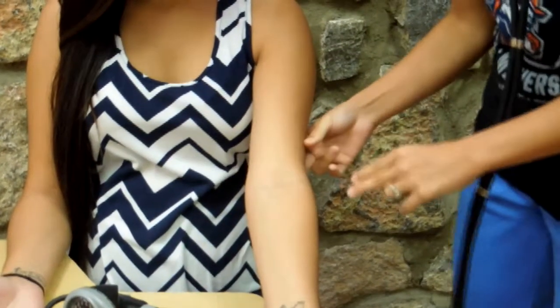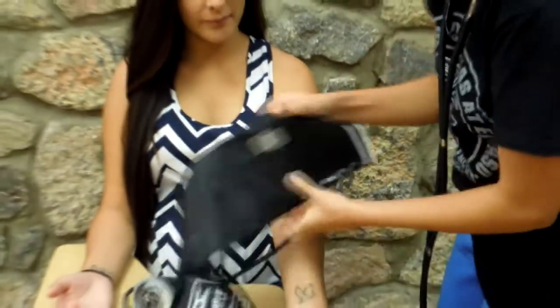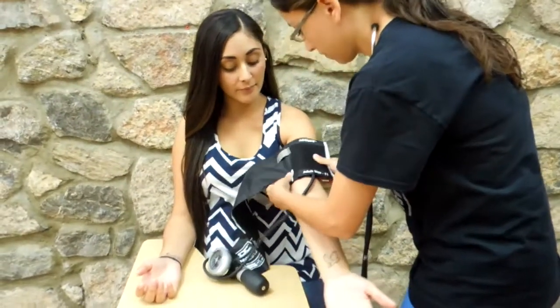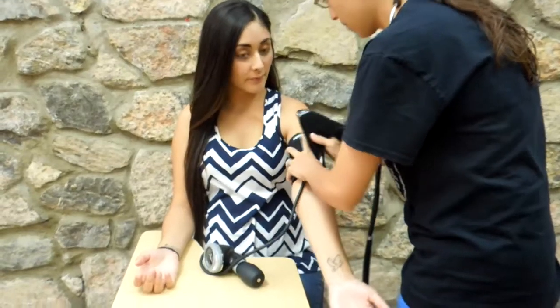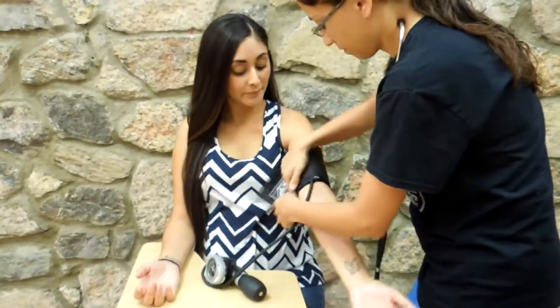To establish accuracy, the cuff utilized must be the right size for the individual. This entails that 80% of the upper arm must be enveloped by the bladder inside the cuff. The majority of the adult population require the adult cuff.